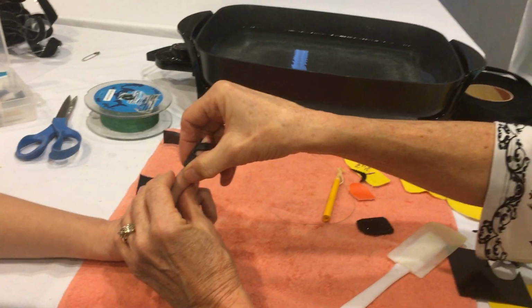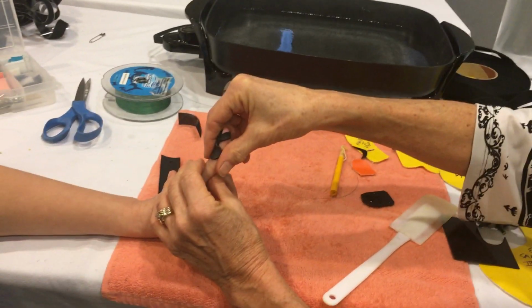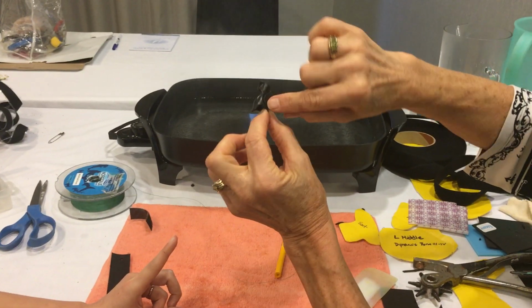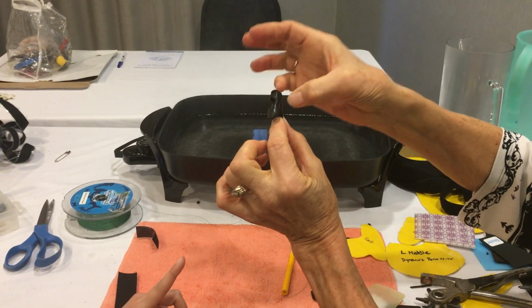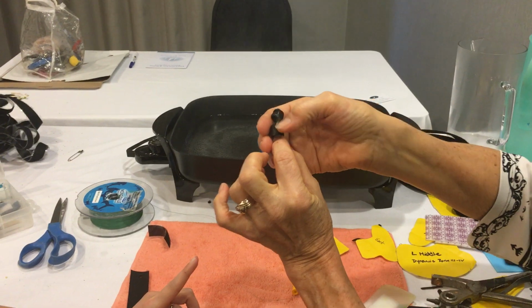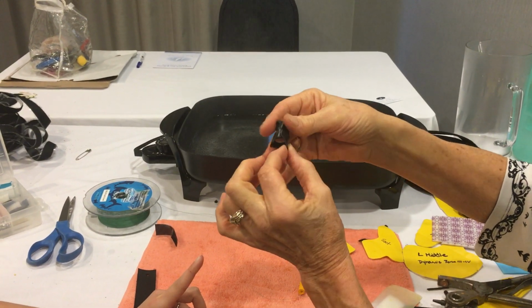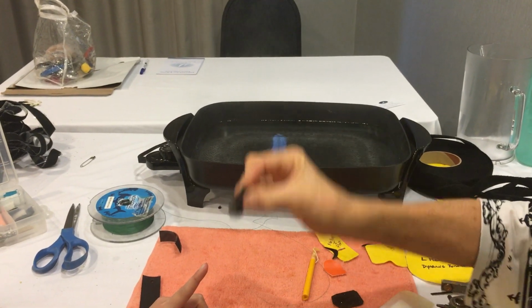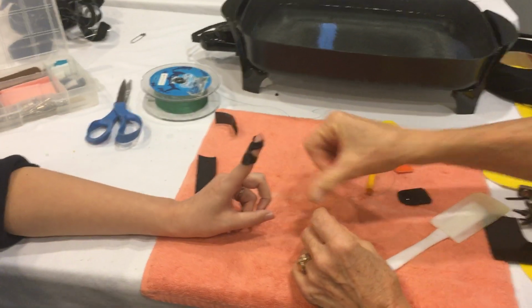So that can just be easily slipped on and off the finger. Now, I often will use the heat gun right here on this edge briefly, just really quick, to seal that down so that it makes a nice permanent bond. But that's the one-piece mallet.